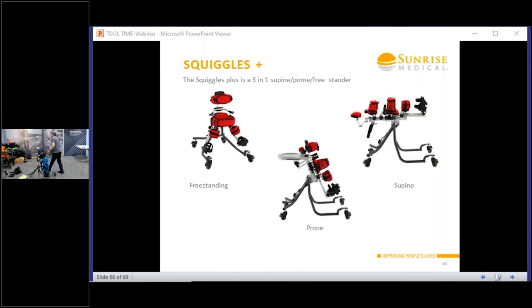All right, so now we're on standers. And it's really important that we think about standing. 24-hour positioning is really important for all of our clients, but I think even more so with kiddos. The really great thing about the Squiggles Plus is it's designed for kiddos to be at the same height as their peers. So the idea is to set the foot plates as low to the ground as possible so they're standing at the same height as their peers. So they can play games, they can interact.